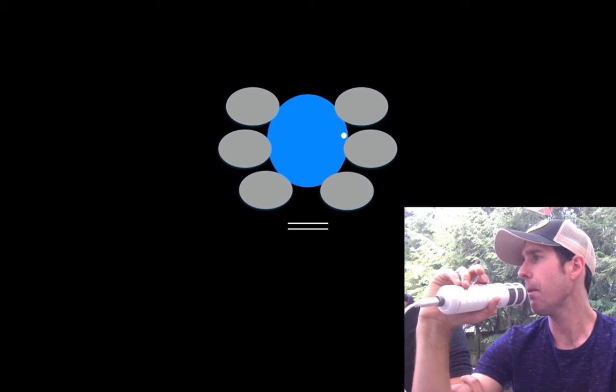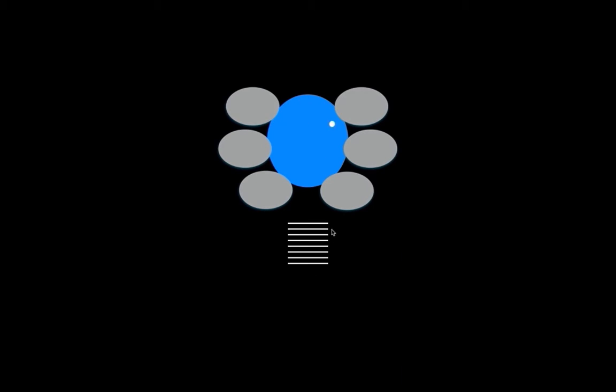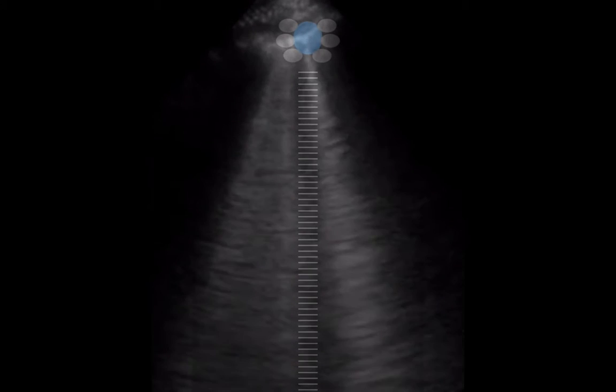You have a small fluid-filled structure like an alveolus surrounded by air-filled structures or other alveoli that haven't quite had fluid in them. And remember I mentioned, when you have fluid right next to air, it creates a very reflective surface for sound. And what happens is that sound beam will come back and ping, ping, ping, hit all the corners and make that noise. And as it makes that noise that you're making with your mouth there, you see how it creates all these tiny reverberation artifacts, and that is how B-lines are formed.